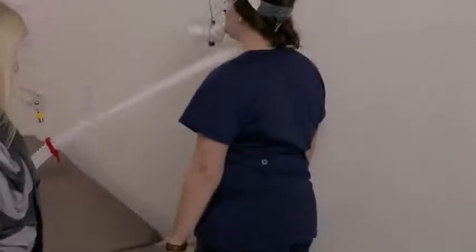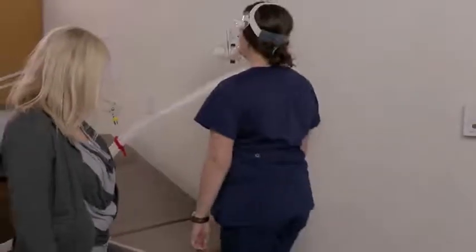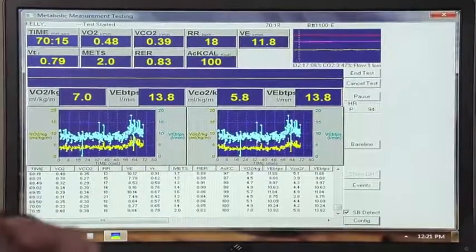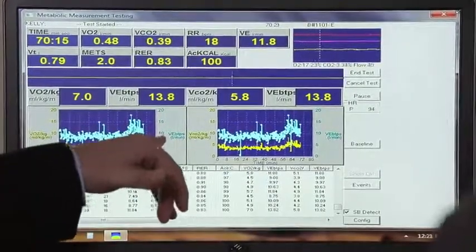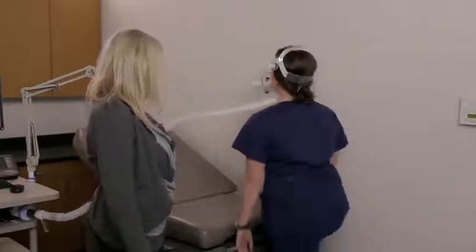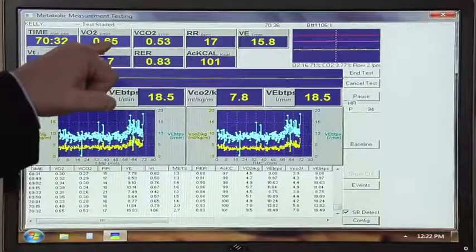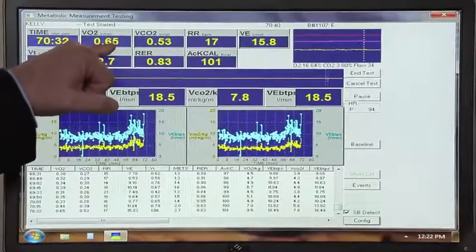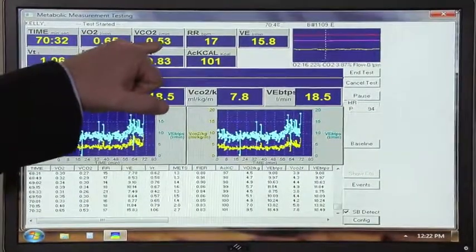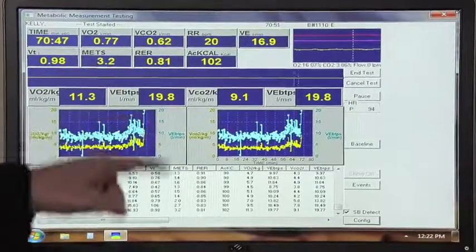And go. Now obviously the faster that we go with the tempo, the more her metabolic rate will increase. We'll do this for a few seconds and then speed it up a little bit. You can see the oxygen consumption is now up into the 0.6s — actually a little more than doubled compared to what it was at rest — and she's producing more carbon dioxide as she combusts more substrate, and the points are moving upwards.